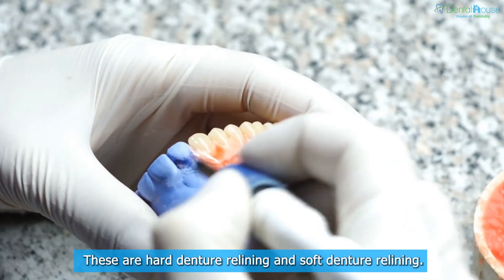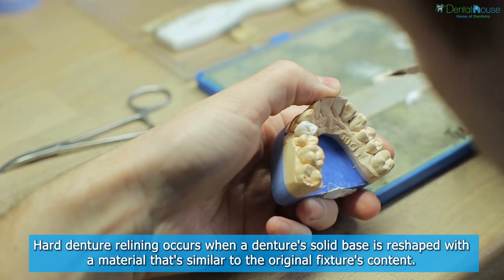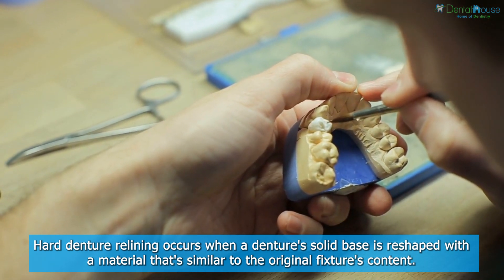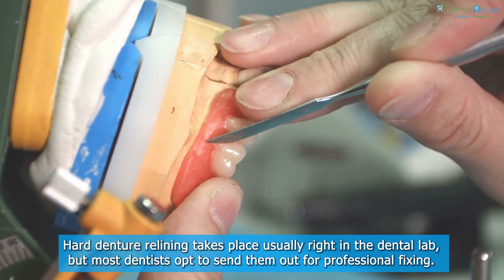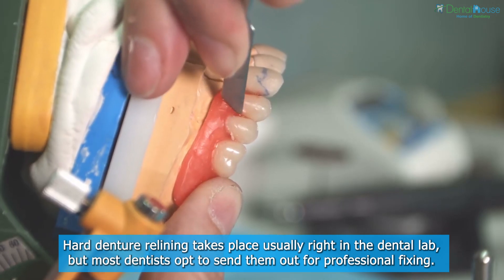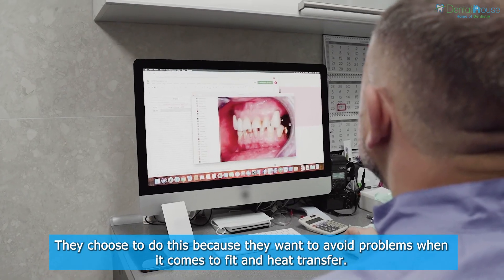Hard denture relining occurs when a denture's solid base is reshaped with a material that's similar to the original fixture's content. Hard denture relining takes place usually right in the dental lab, but most dentists opt to send them out for professional fixing to avoid problems with fit and heat transfer.